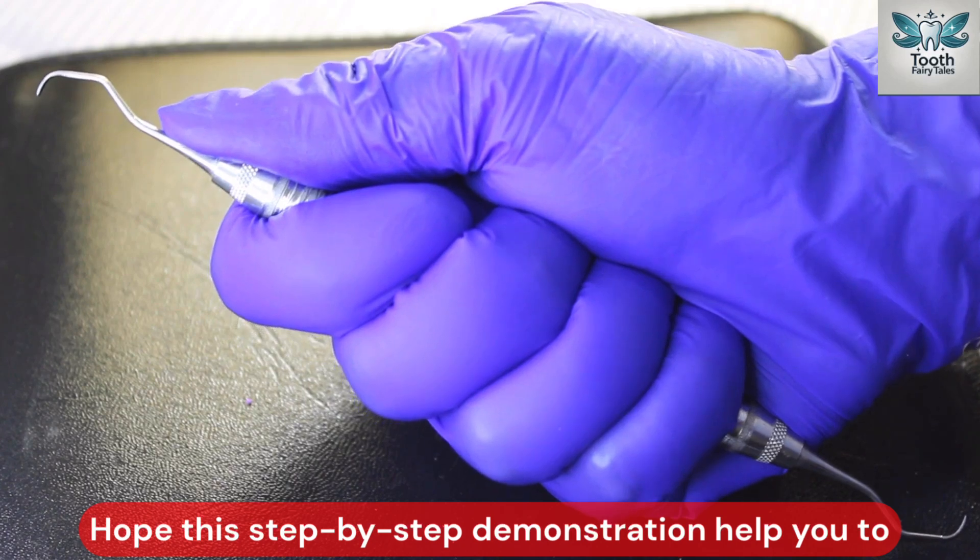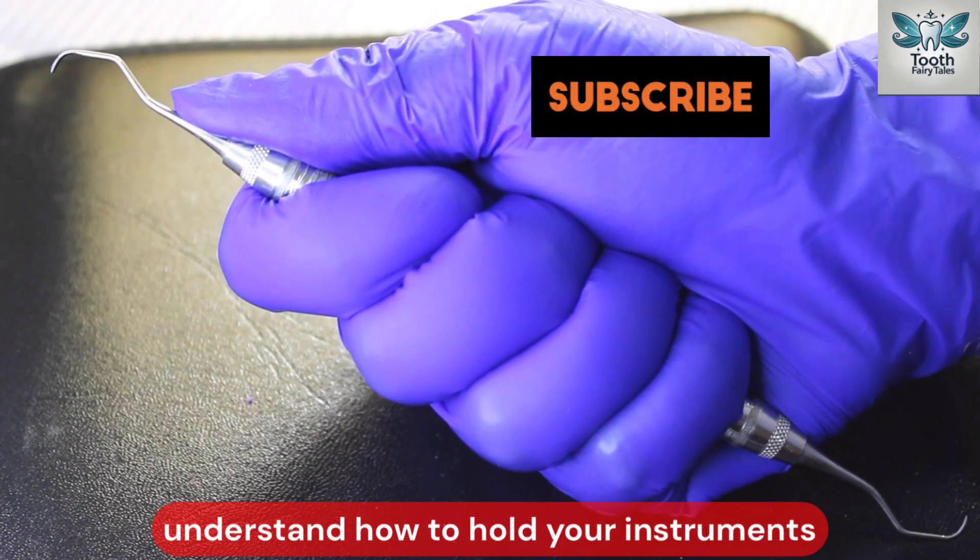Hope this step-by-step demonstration helps you understand how to hold your instruments properly.